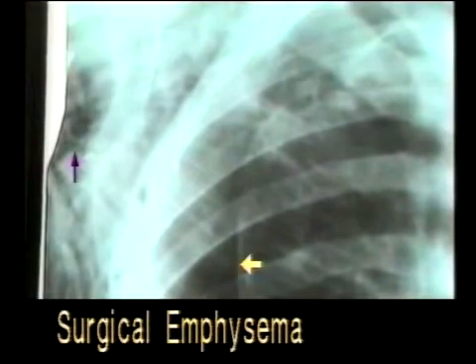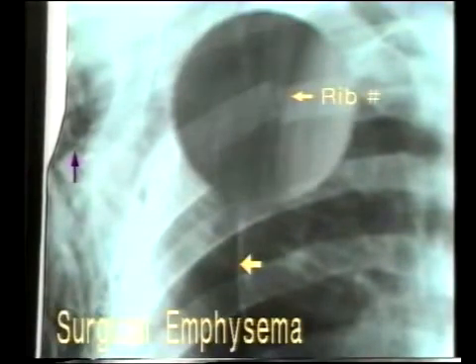Now, a careful inspection of all the ribs will reveal a rib fracture which has caused the pleural injury and air leak.